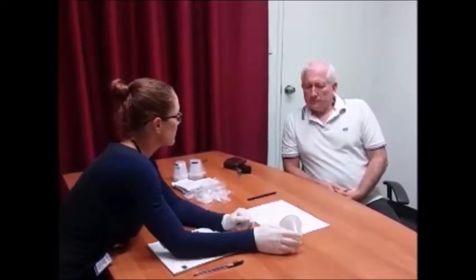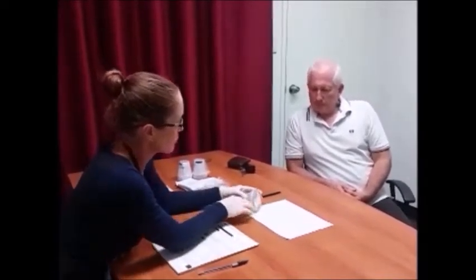Michael, so the test is developing. Turn it around this way. It is still sitting. So your sample is climbing up the profile cards. We want to see pink lines appearing across the T region and the C region. So lines are good. Light or bright, a line's a line. The C's up here are the control lines that prove to us that this test is working correctly. The T region is the test region. That's how we ascertain if something is in your system or not.